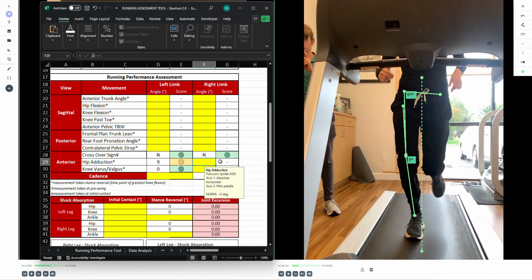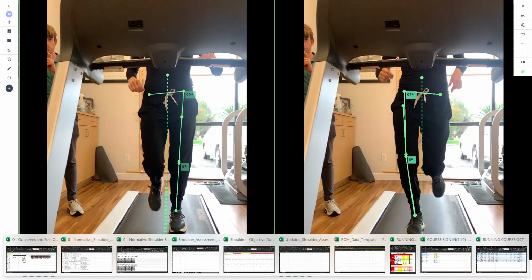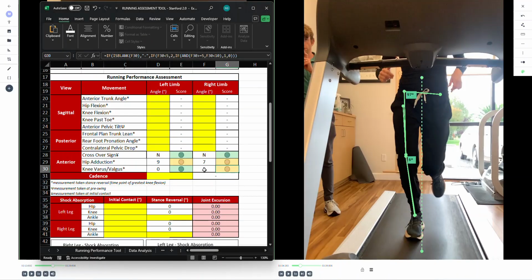When we look at the right, we were at 7 degrees, and I'm taking that off of the 97. There was a 5-degree knee varus, which is borderline, but enough that there's slight deviation. Even if we manipulated this to be a little more centered, I would say that's probably more bisection of the lower shank. Again, there's about a 3 to 5 degree error rating depending on the metric, so 5 or 6 doesn't much matter. It's within that area for mild improvement.